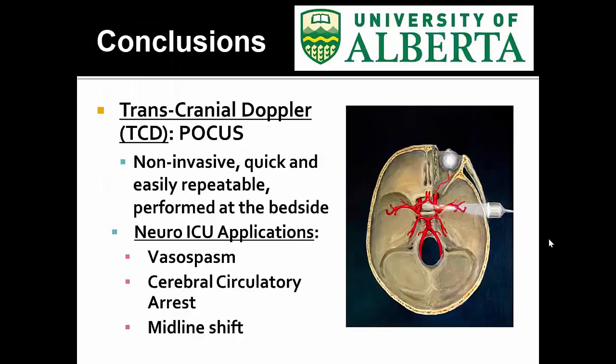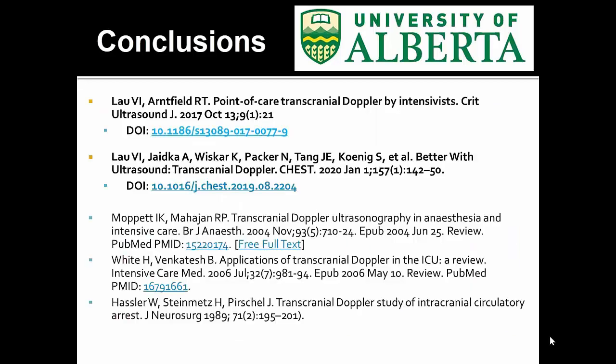In conclusion, transcranial Doppler TCD POCUS is a non-invasive, quick, easily repeatable tool performed at the bedside for a multitude of neuro-ICU applications, which includes vasospasm, raised ICP, cerebral circulatory arrest and midline shift. The previous impedance to use of TCD was secondary to lack of machines and expertise. However, with the ubiquity of point-of-care ultrasound machines, hopefully TCD POCUS can become more widespread.